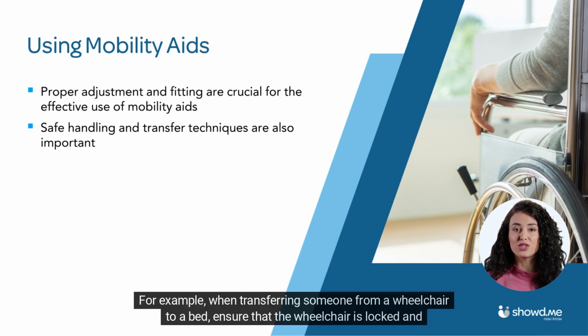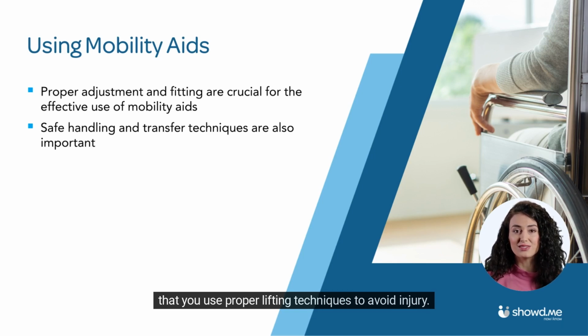For example, when transferring someone from a wheelchair to a bed, ensure that the wheelchair is locked and that you use proper lifting techniques to avoid injury.